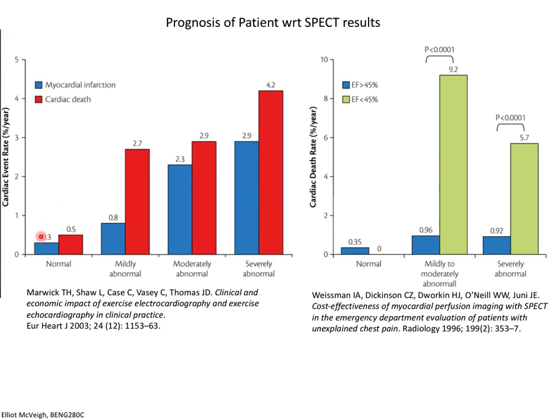And it's quite different for those who come out of that scan normal. So I would say this is the dividing line. It's interesting that there isn't much difference between these gradations of abnormality in terms of your probability of having an event. 3 to 4 was a bit. But there's a big gradation across this line. If you come out normal, you have a very low probability of having a cardiac event, right, than here.